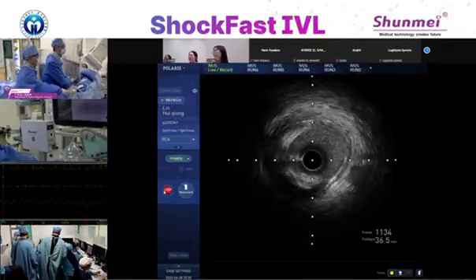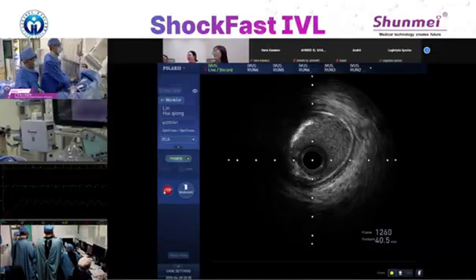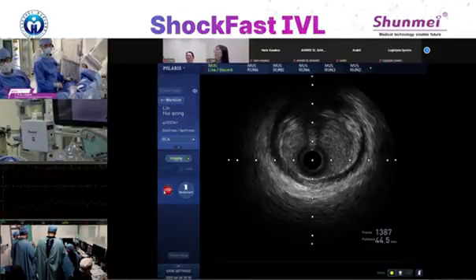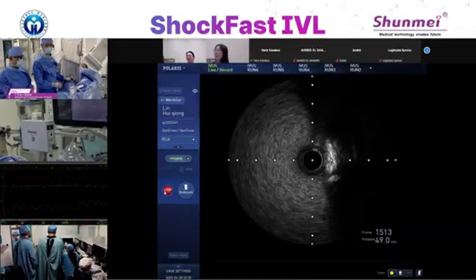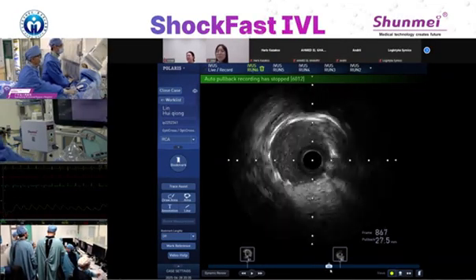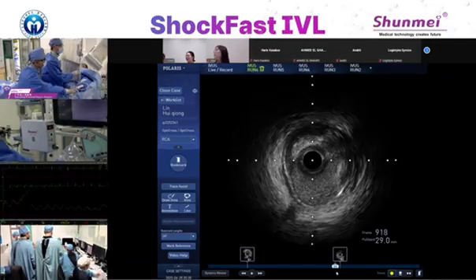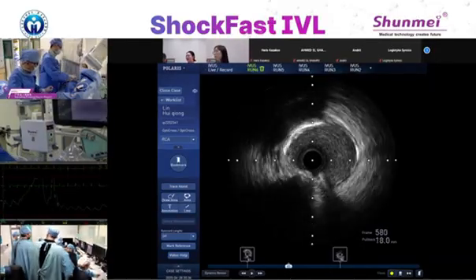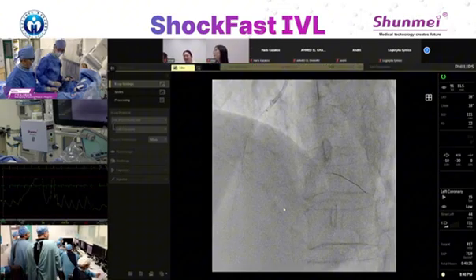How about the aorta? Make sure there's no dissection. Everything's fine. Pull out the IVUS and set the Godzilla for one more shoot.